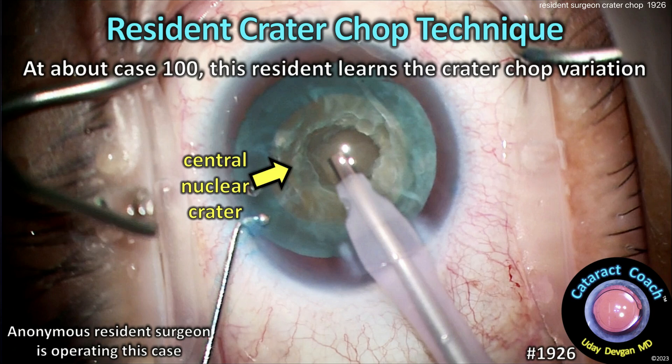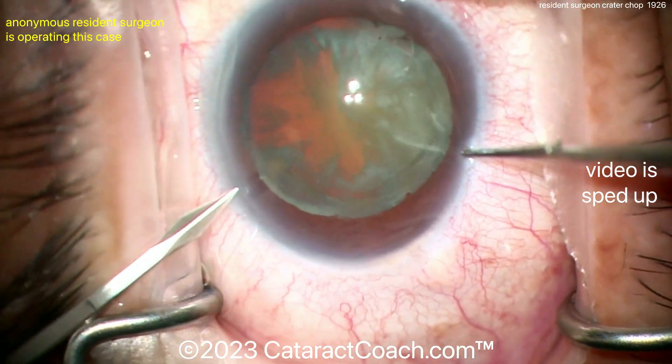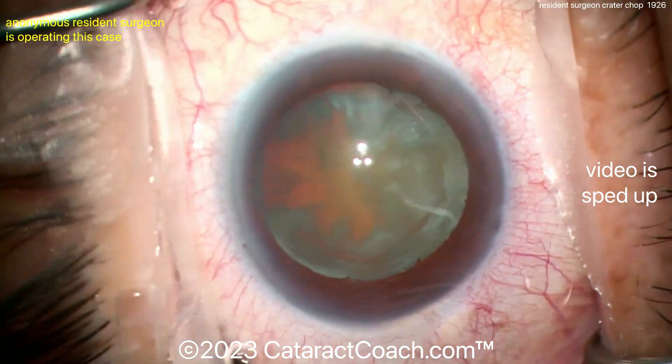CataractCoach.com resident crater chop technique. This is about case 100 and the resident does a great job learning this crater chop variation of horizontal chop. The video is sped up here and you can tell there is an attending surgeon giving some guidance.